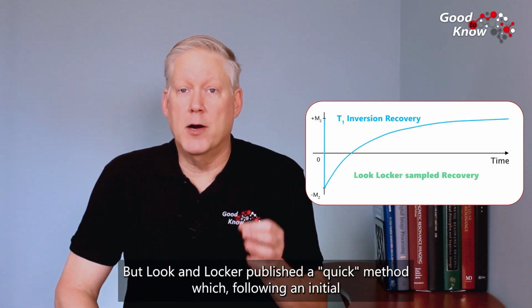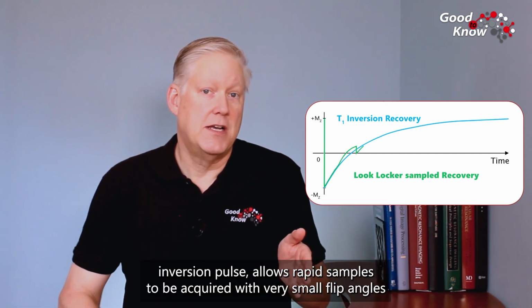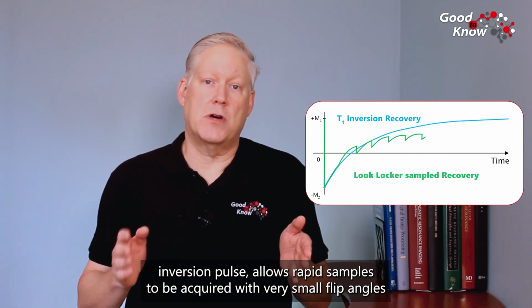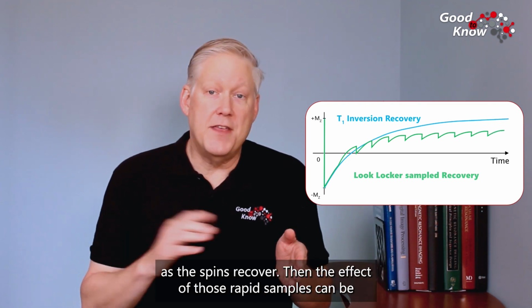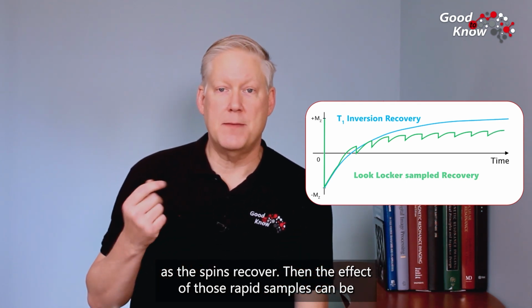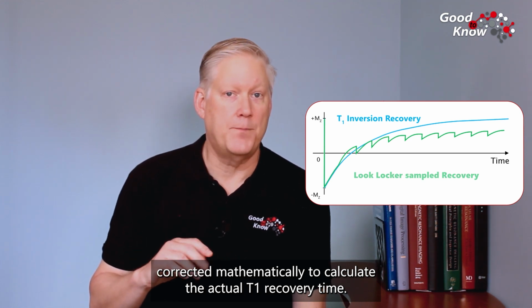But Look and Locker published a quick method which, following an initial inversion pulse, allows rapid samples to be acquired with very small flip angles as the spins recover. Then the effect of those rapid samples can be corrected mathematically to calculate the actual T1 recovery time.